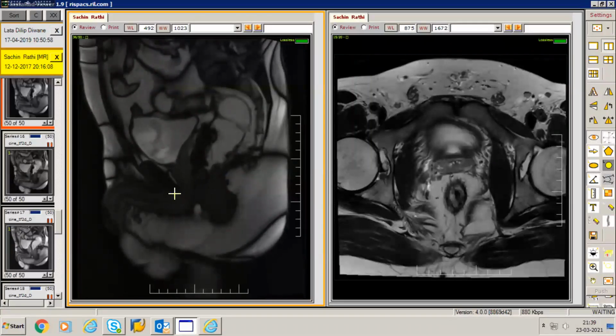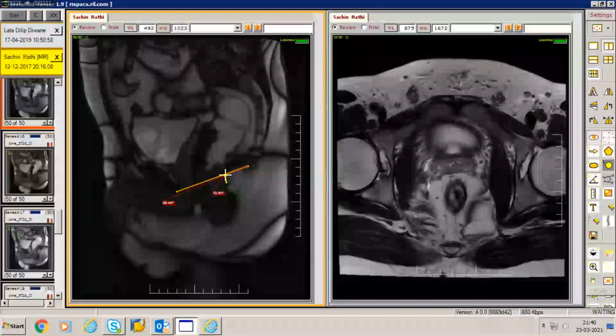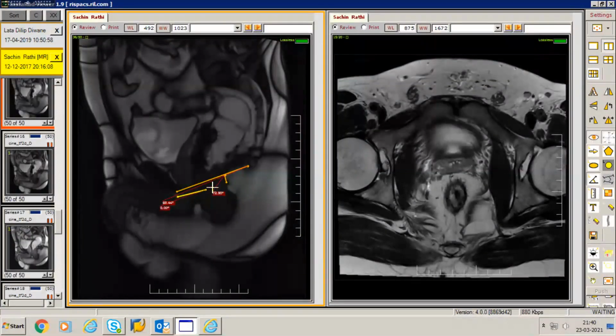So you would again draw a pubococcygeal line starting from the pubic symphysis to the last intercoccygeal joint. And at the same time, you would draw again the M line. The M line, as I told you, would be from the level of the anorectal junction to the pubococcygeal line. So if you can see on this particular patient, the anorectal junction is slightly lower than that. During the strain mechanism, because there is an elongation of the levator hiatus along its anterior-posterior dimension, you would see that the H line would be a longer dimension as compared to what it was during the rest phase.